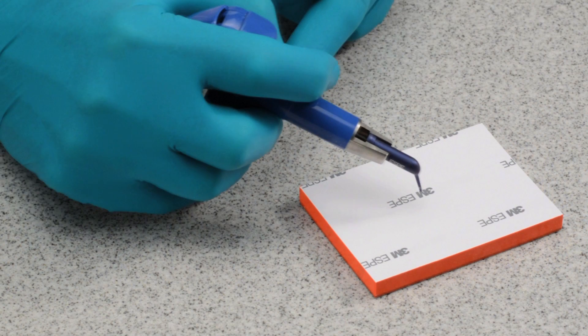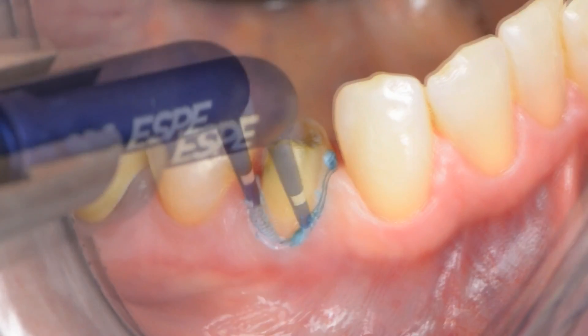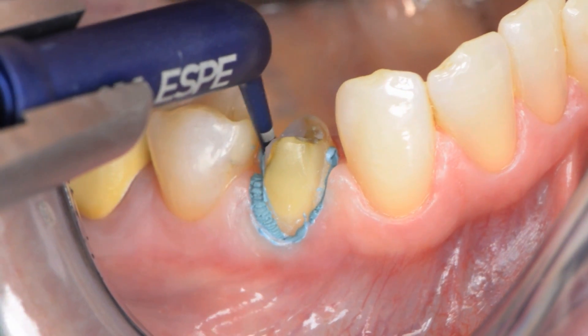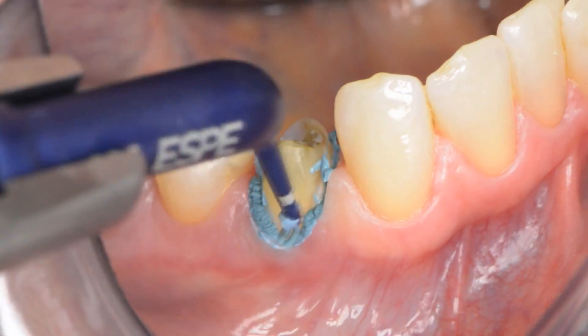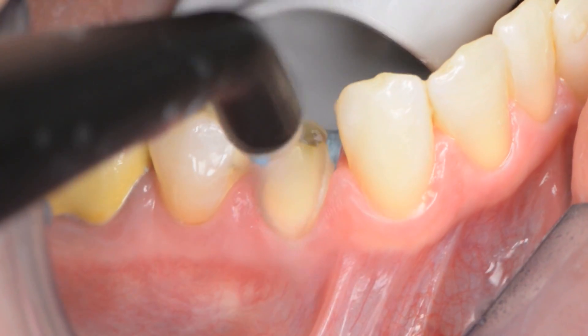3M ESPE Retraction Capsule. Dispense a small quantity of paste onto a mixing pad. Introduce the capsule tip into the sulcus, opening the sulcus. Rinse the sulcus thoroughly with water and dry lightly with air before application of the paste.